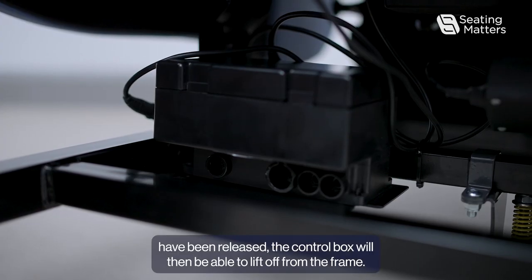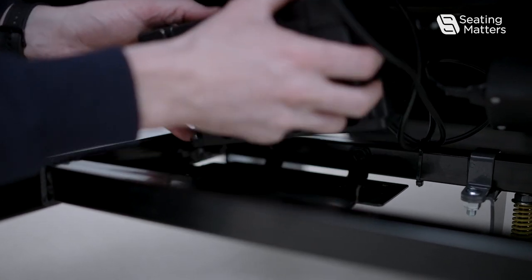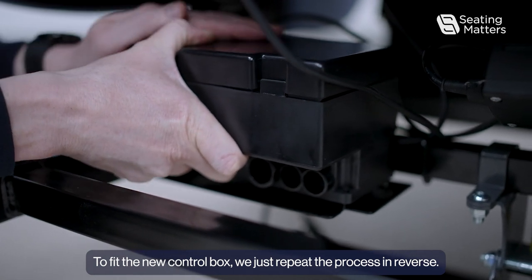Once the two nut and bolts have been released, the control box will then be able to lift off from the frame. To fit the new control box, just repeat that process in reverse.